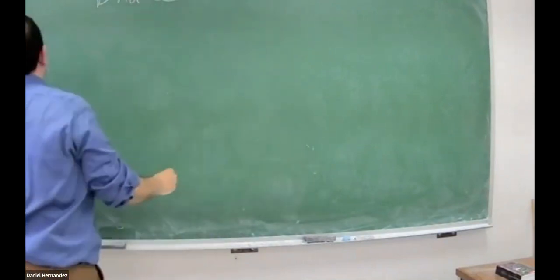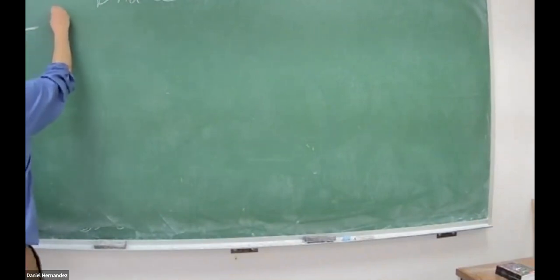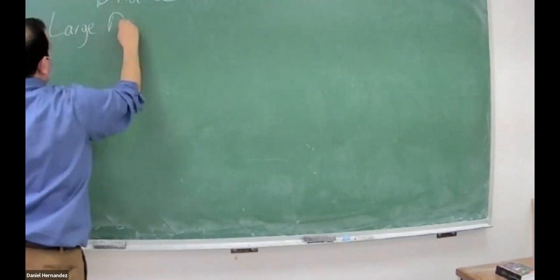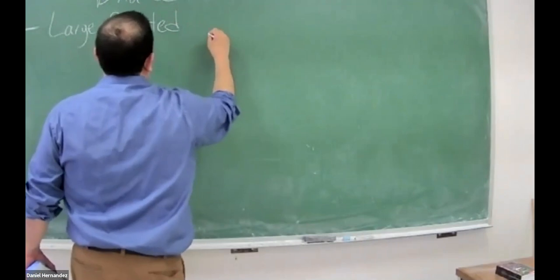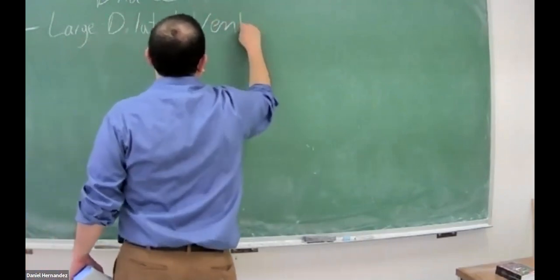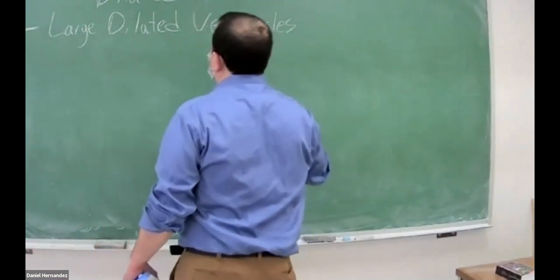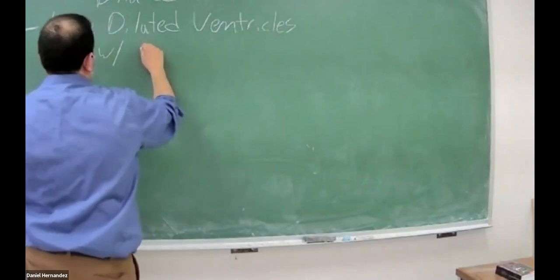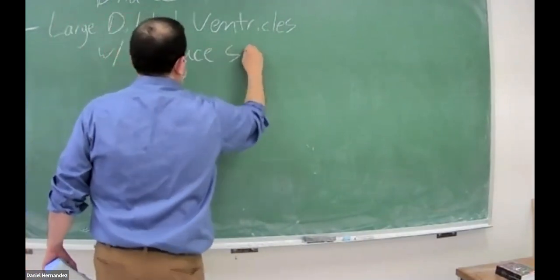Cardiomyopathy. Large, with reduced systolic function.